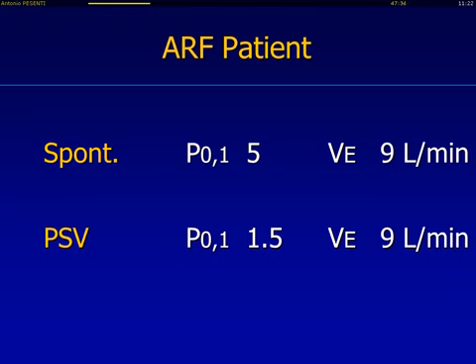And if we apply pressure support, we might be able to bring this PO1 down to 1.5 and have him happy with it. What does it mean? It means that here the patient is dyspnoic, he's panting like running. Here, as far as breathing is concerned, he's as happy as sitting at a table drinking a beer. This patient will last breathing for days, probably. This will be tired, fatigued in a short time.